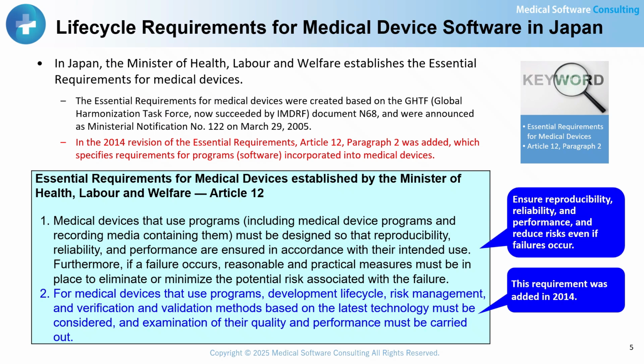Let me explain why compliance with IEC 62304 is required under Japanese medical device regulations. First, according to Article 41, Paragraph 3 of the Pharmaceutical and Medical Device Act, the Minister of Health, Labor and Welfare may establish necessary standards. These are called the essential requirements for medical devices. The original concept of the essential requirements was developed by the Global Harmonization Task Force, or GHTF, and today it is maintained by the IMDRF, the International Medical Device Regulators Forum. The same document is also used as the basis for medical device regulations in the European Union.